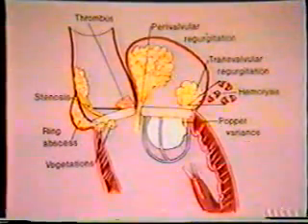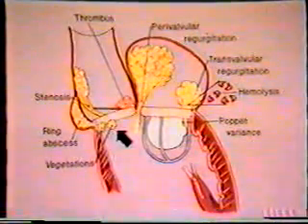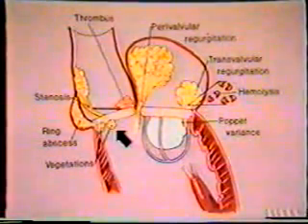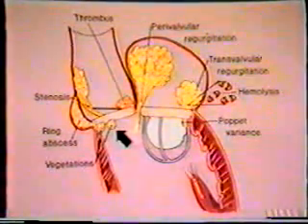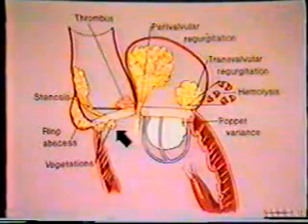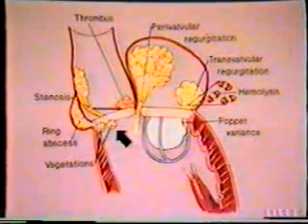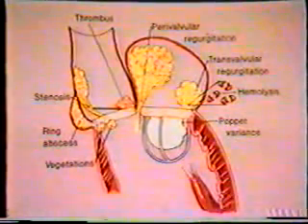Both mechanical and bioprosthetic valves are subject to infective endocarditis. Because of multiple reverberations, it is difficult to diagnose mechanical prosthesis endocarditis by surface echocardiography. But transesophageal imaging allows us to detect mechanical valve vegetations. We will now illustrate such a case.